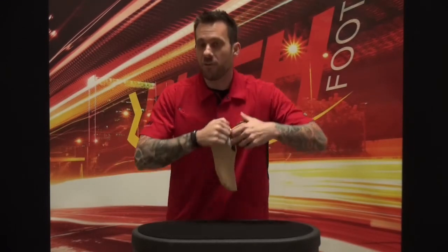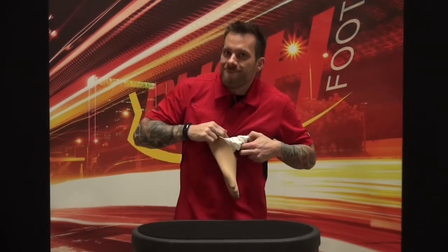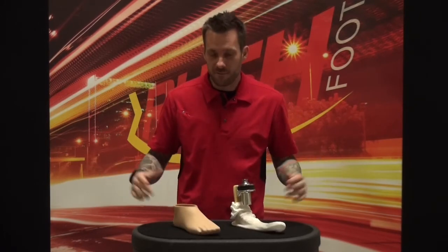So this does take a little muscle. Excuse me and bear with me while I brace myself and pull. But as long as I brace right about there and pull, that's it. It disengages itself very easily. The foot shell is now off.